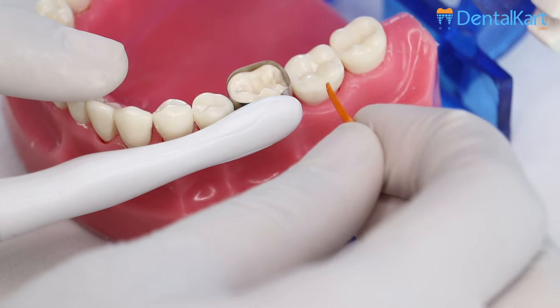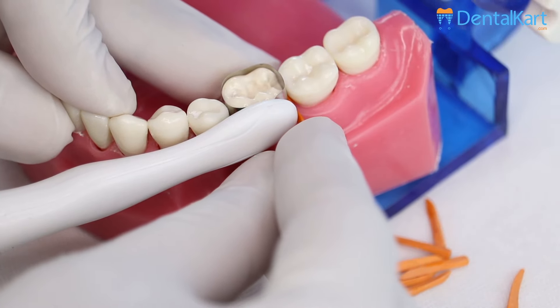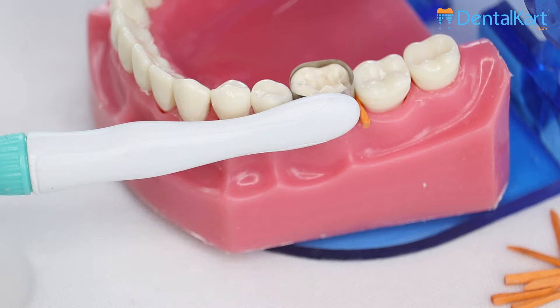Now I will place a wooden wedge. Wedges assure close adaptability of the matrix band to the tooth surface and prevent gingival overhang of the restorations. You can see we have achieved a beautiful proximal contour.